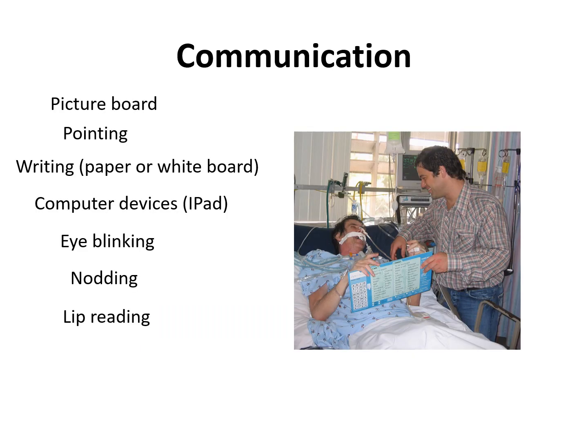The patient is not able to speak, obviously, so be very considerate when you're in with a patient, and if you're with another coworker and talking around the patient, just because they can't communicate doesn't mean they can't hear. So be very cautious of what you're saying and how you're saying it. You should talk directly to your patient and explain to them everything you're doing, even if you don't think they can hear you. It is good nursing care to do that.